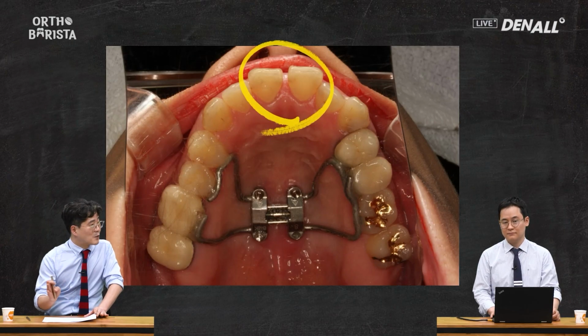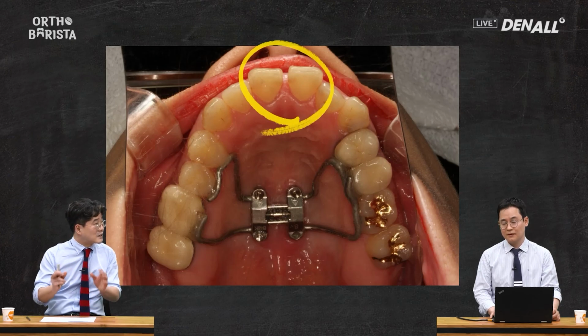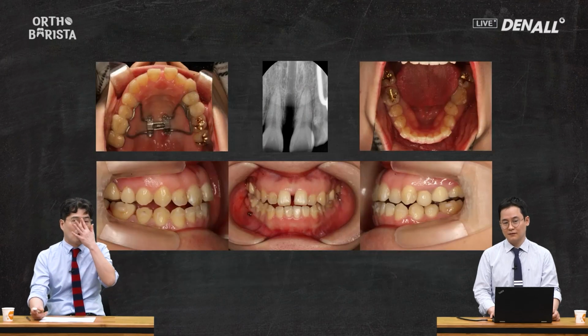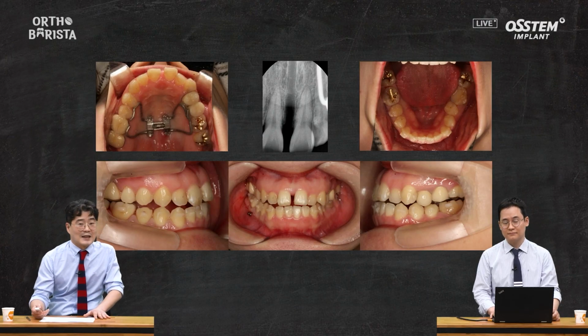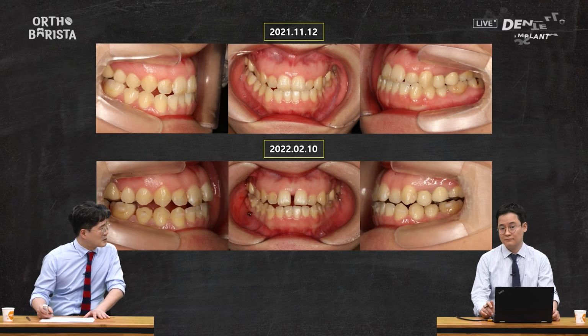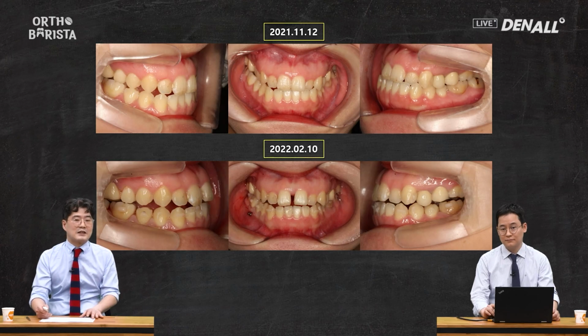Personally, in cases where expansion is needed with clear aligners, I often use Marpe. This device is particularly helpful because it can be combined with aligners, and even after cutting off the arms, it still maintains stability. It seems to be a device that pairs well with clear aligners. Similarly, elastic bands are used throughout the treatment. The upper arch also shows significant expansion. Ideally, aligners alone would handle this level of expansion, but achieving that is still quite challenging. For now, auxiliary devices remain essential to achieve the desired outcomes.